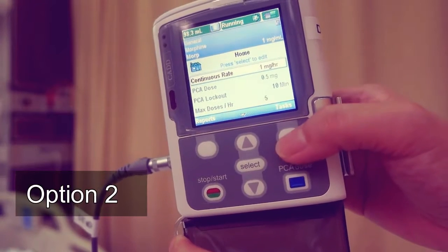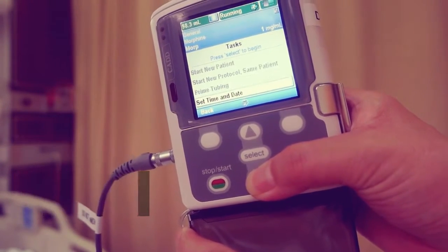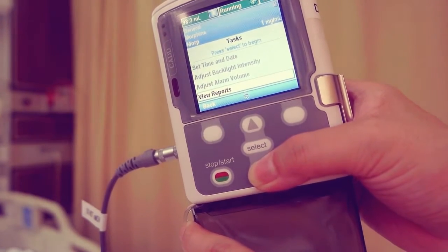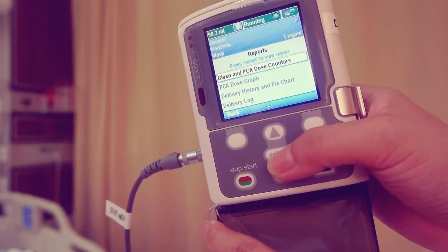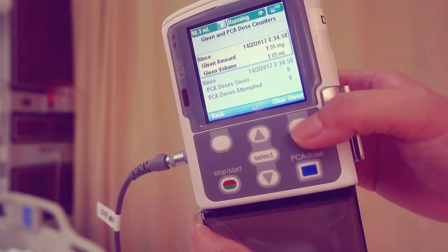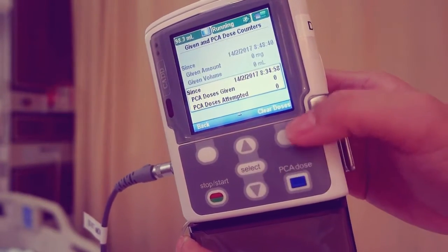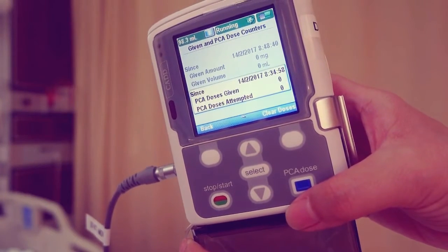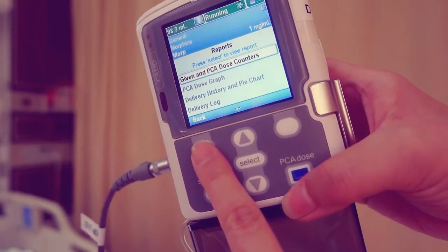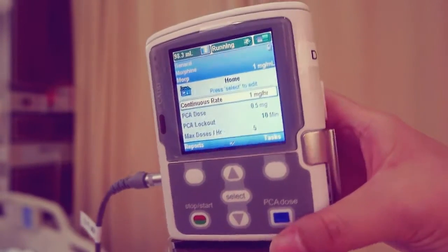From the home screen, press task. Scroll down to view reports and press select. Highlight given and PCA dose counters. Choose clear given to clear total given and scroll down to PCA doses given attempted, and press clear doses. Press back to return to the reports menu and press back again to return to the home screen.